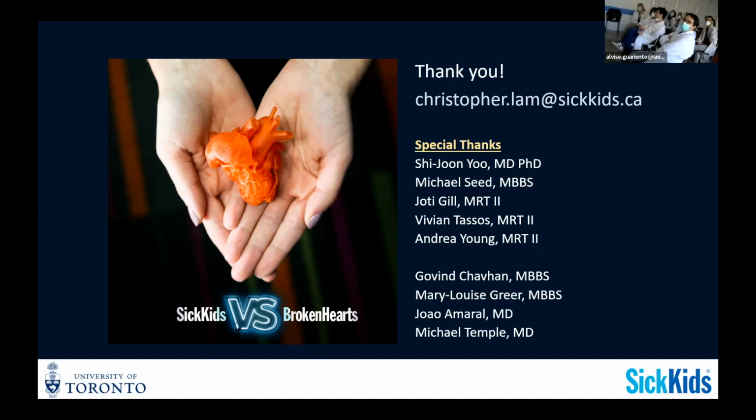And do you perform a cardiac MRI before, and then the lymphatic one in the same session? Oftentimes we'll do a cardiac MRI first for Fontan, and that will have the T2 MRL. And then later we will do a dynamic contrast enhanced MRL separately under GA, because the Fontan cardiac MRI is non-sedated. And in that case, we'll also do the cardiac hemodynamics. Later we will bring them back for a dynamic contrast enhanced MRL specifically if they have Fontan failure. In that scenario, we may proceed directly to catheter-based intervention after the MRL and under the same anesthetic. So you have the cath lab near to the MRI? Yeah, we do it with the interventional radiologists. It's not combined, but it's very close together.